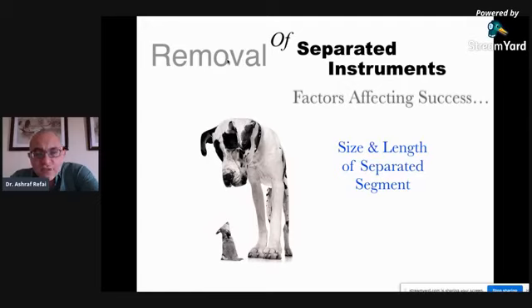He's done a lot of research on this, and it's very, very amazing, because he's also combined using different types of lubricants or media during the instrument retrieval process, EDTA, different types of oils, and he's come up with some very fantastic results. So whether you're using a loop or a tube system in its removal, and I'll be discussing those in a few moments, the length and the size of the instrument makes it harder or easier to come out. Smaller pieces of instruments are relatively easier to come out. They'll come out with ultrasonics, while longer ones and bigger files will probably require to be pulled out because they engage more with the lateral dentin.